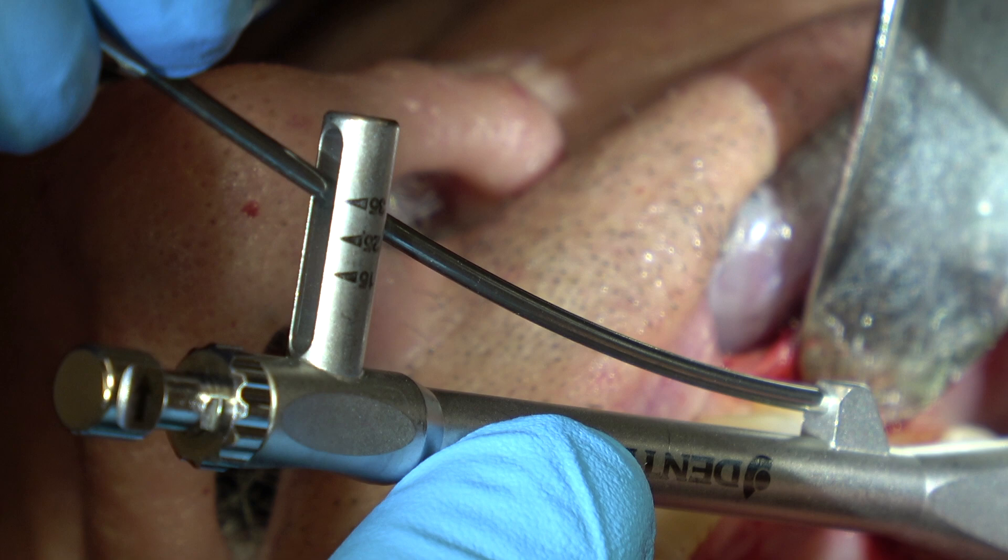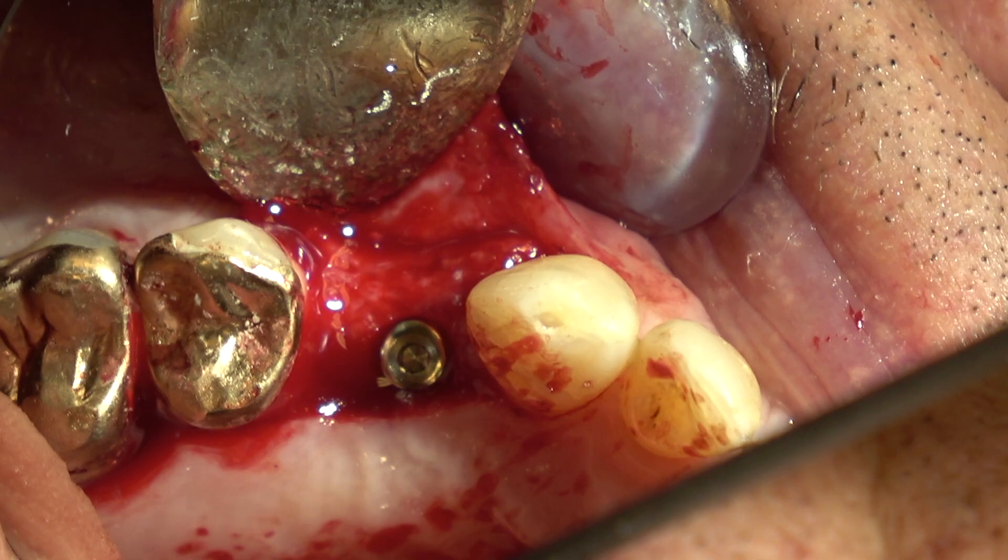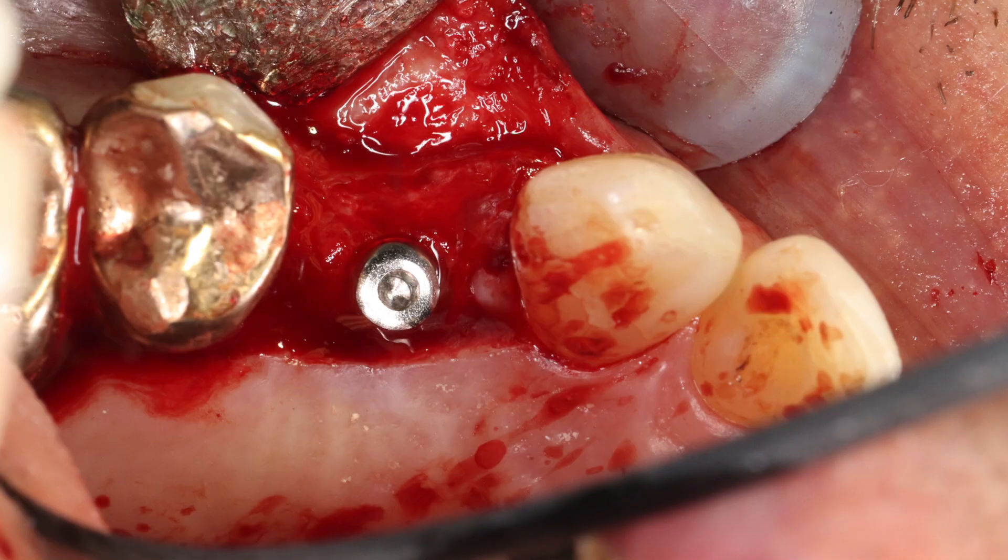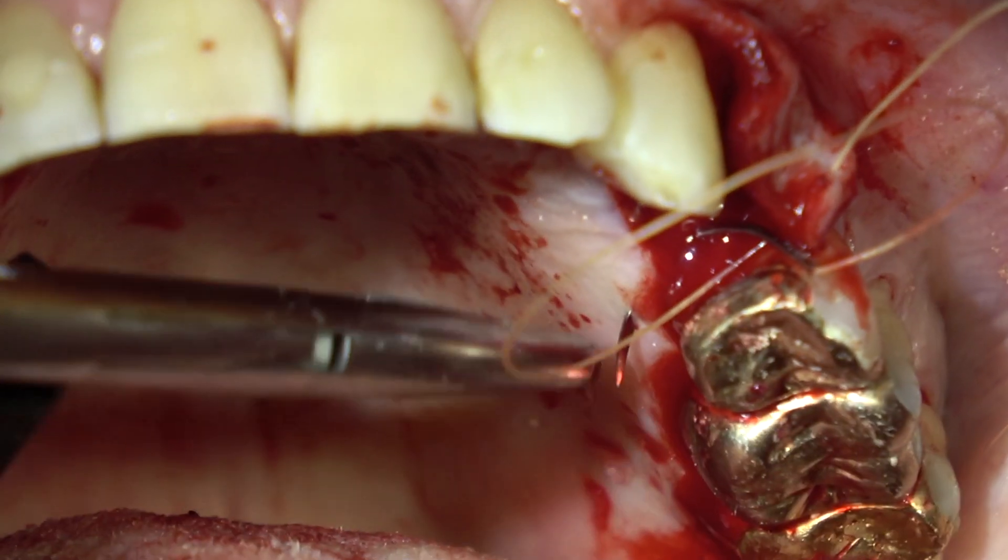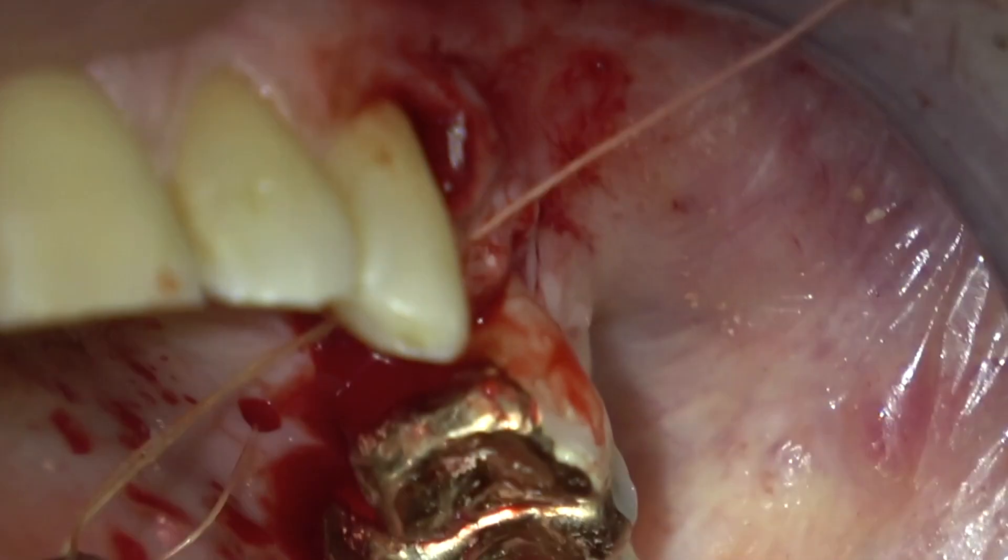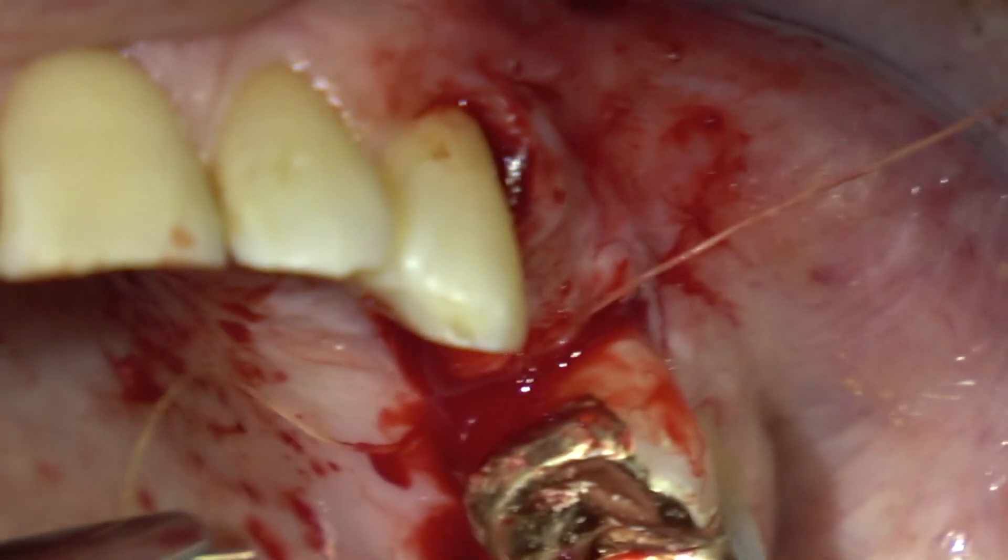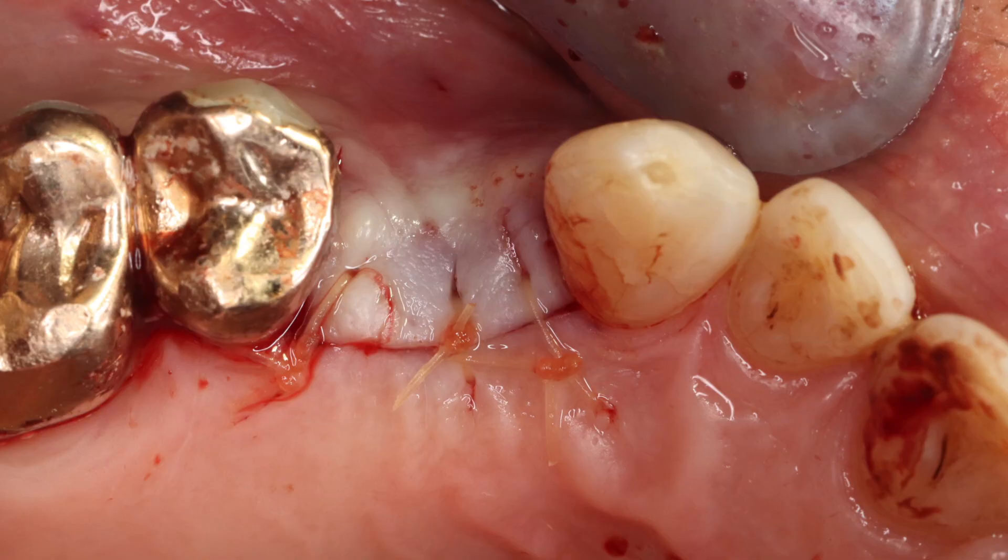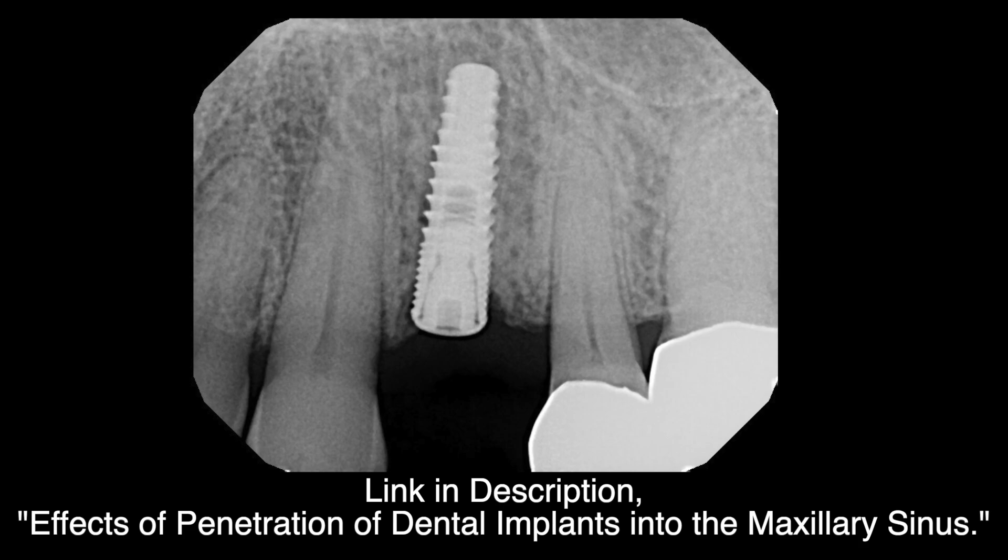Screw the implant in to 35 Newton-centimeters, then screw the flat healing cap on top and suture it. This is 3-0 gut. I've got one suture on the mesial, one on the distal, and one in between. We'll let that heal for three months.